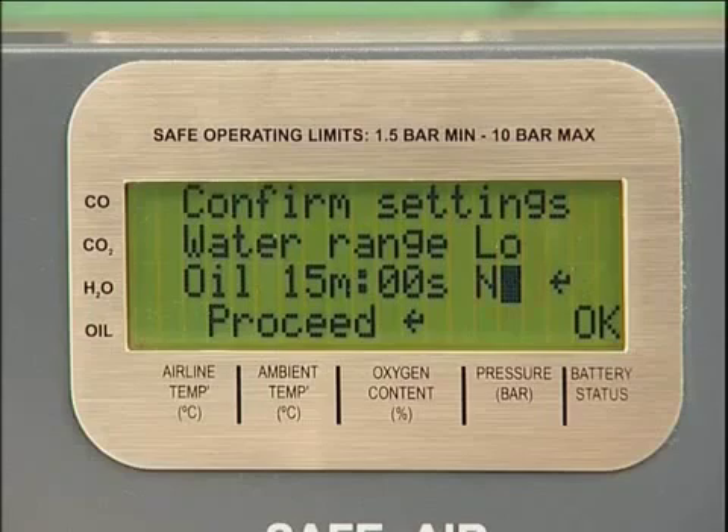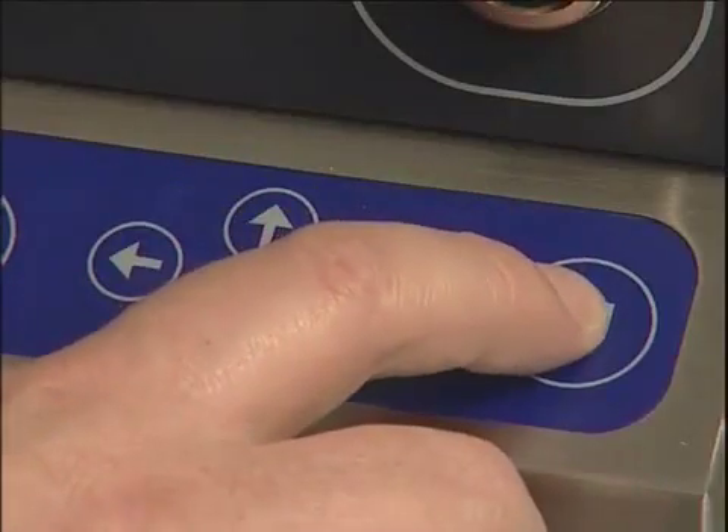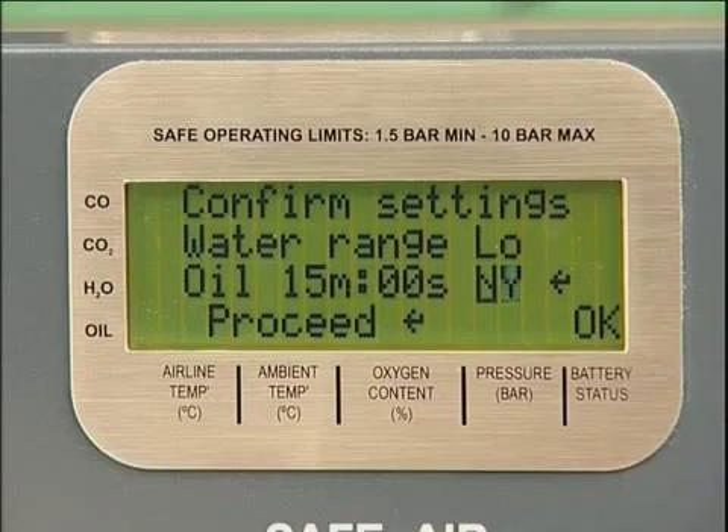Confirm that all settings are correct by selecting Y and pressing Enter. If settings are not correct, select N and repeat the previous procedures, correcting any errors using the scroll buttons. Confirm the amended settings by selecting Y followed by Enter to move to the next screen.